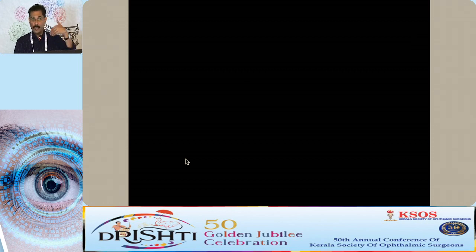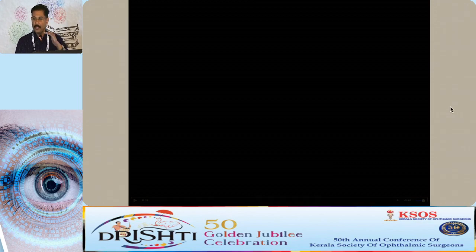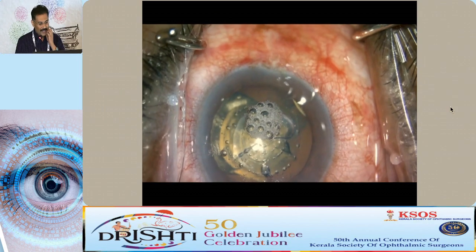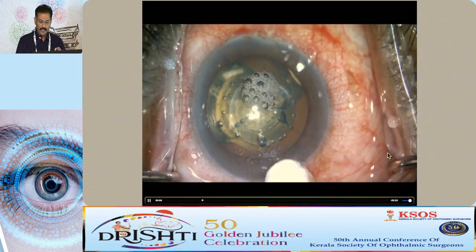And sometimes you get it along paracentesis or incisions through which you have injected viscoelastic. So viscoelastic or something goes in between, then it is very difficult to oppose it. You will have to have venting incisions and then place in C3F8 or something and iron it out for a long time. We had to bubble a case twice because there was visco in between the DM and the stroma.